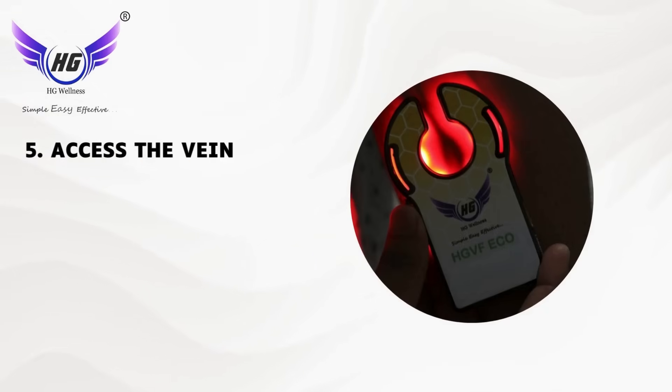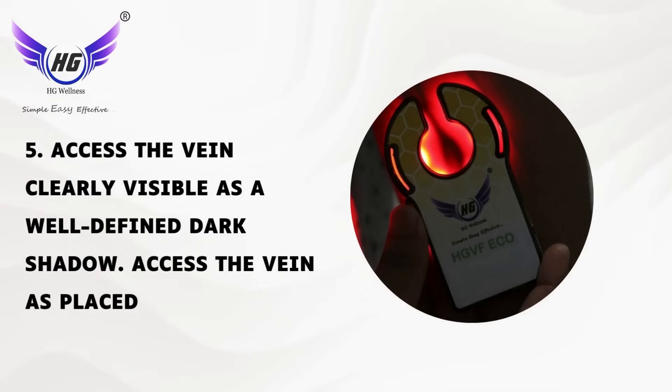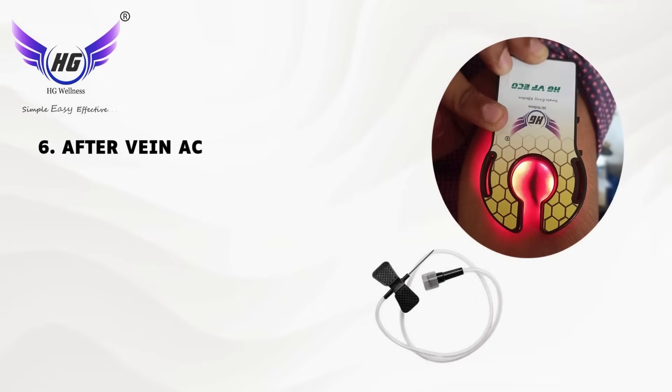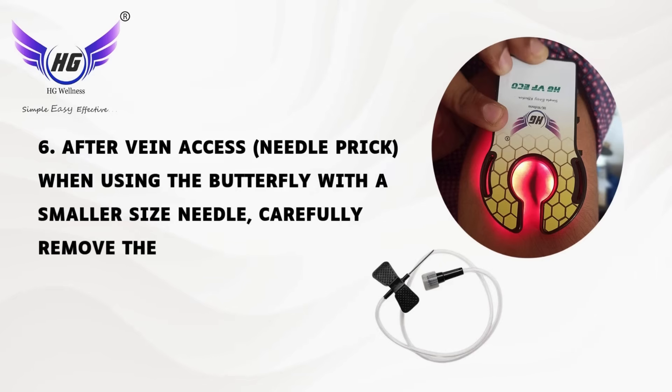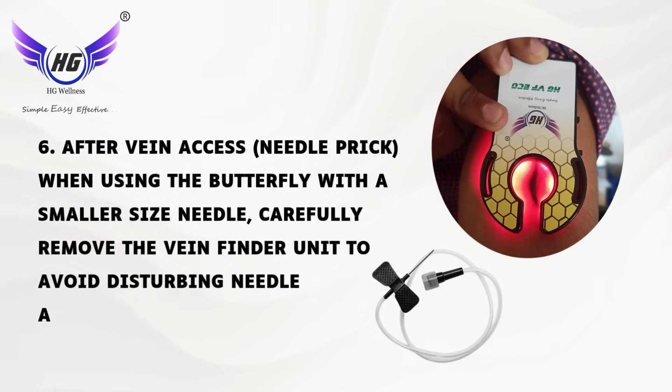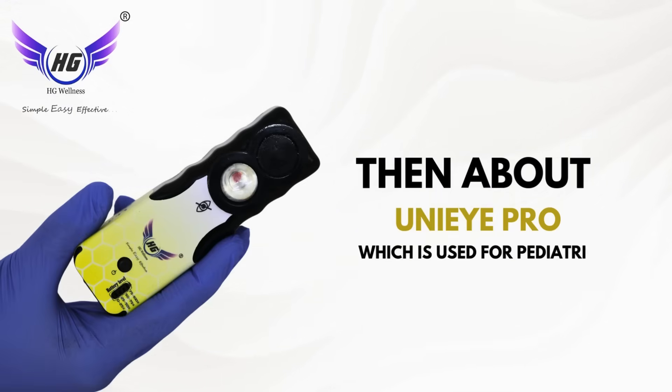Fifth, access the vein clearly visible as a well-defined dark shadow. Sixth, after vein access, when using a butterfly with a smaller size needle, carefully remove the vein finder unit to avoid disturbing needle alignment. Then, about the Uni-Eye Pro, which is used for pediatrics.